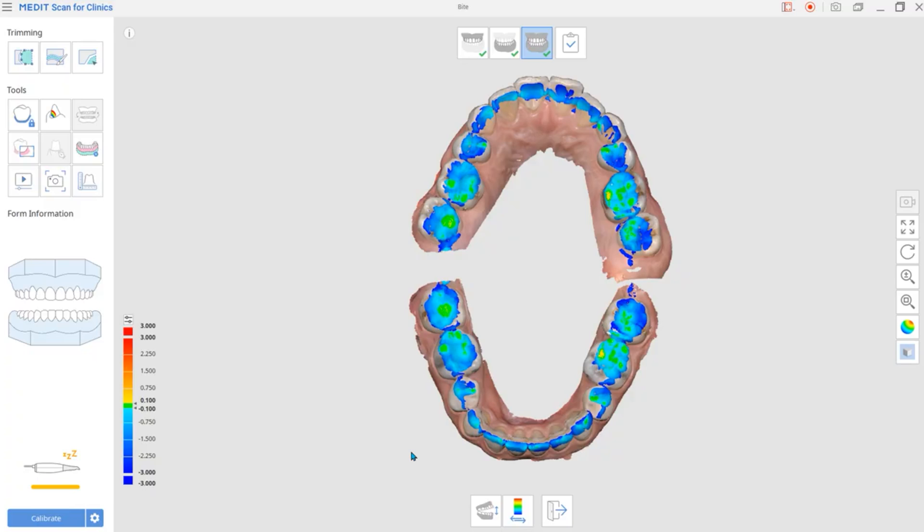Areas with interferences indicate a blue color, having negative deviation values. Areas without interference display yellow and red, having positive deviation values.